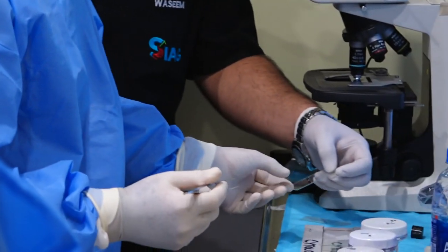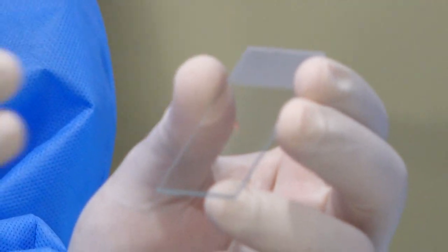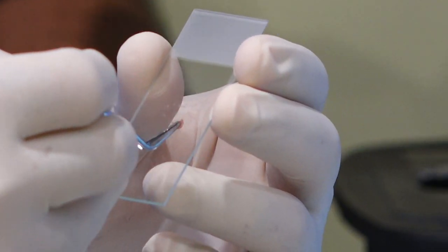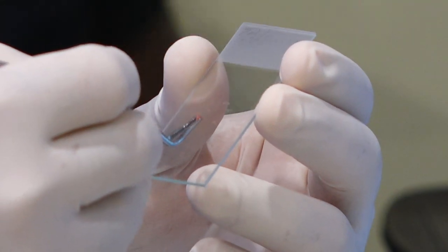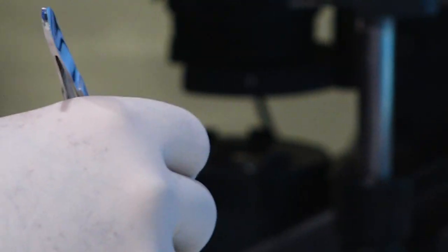Now, what we see here are thick cores of tissue. And the key instruction point here is not to take another slide and put it on top of that and smudge it. If you do that, you're going to destroy that core and no one will be able to assess its architecture in a block. Instead, we take our tweezers and gently hold that core and rub it along the slide so that the cells on top of it rub off onto the glass. And once we're done with that, we put our cores into formalin.